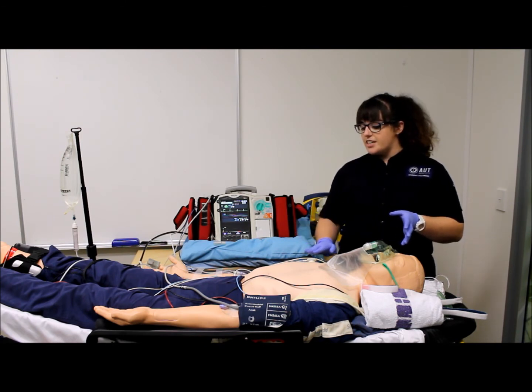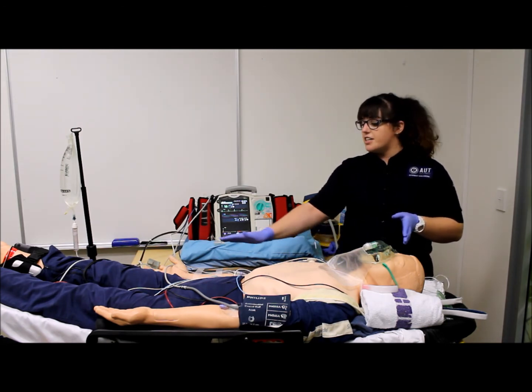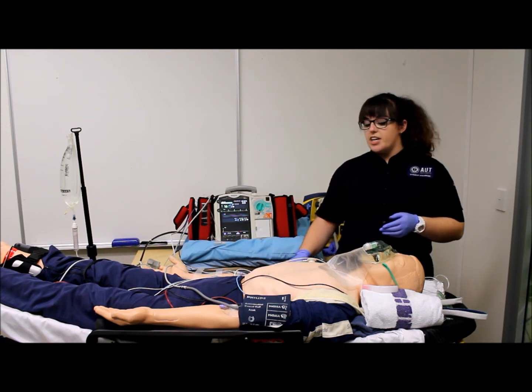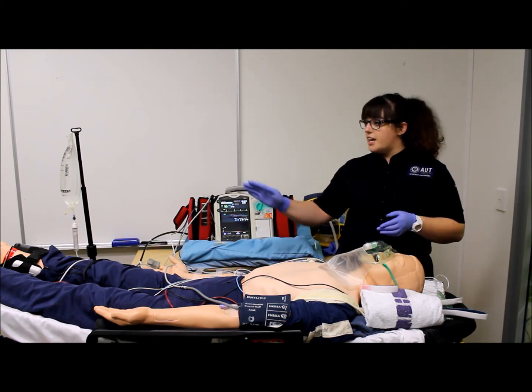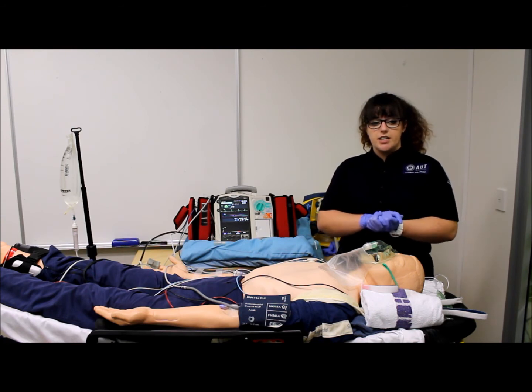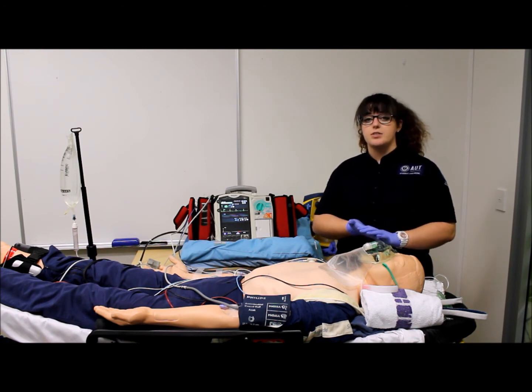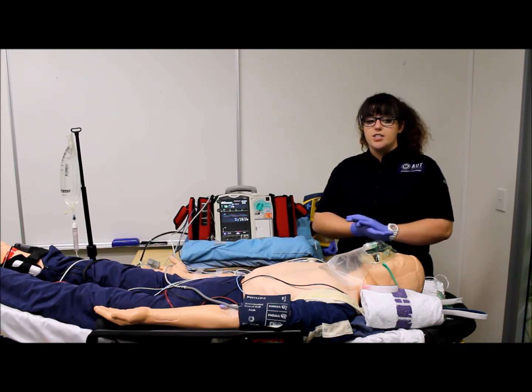We have attached our defib pads, our electrodes for our ECG, our blood pressure monitor and our SpO2. We have bilateral IV access and have some fluids running, treating for querying a TBI currently. We also have morphine for if our patient becomes a bit agitated or combative, to try and control that.